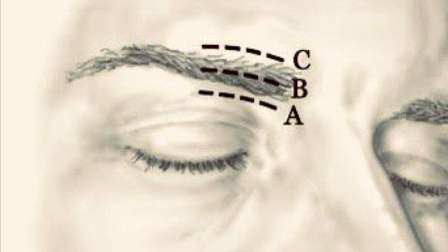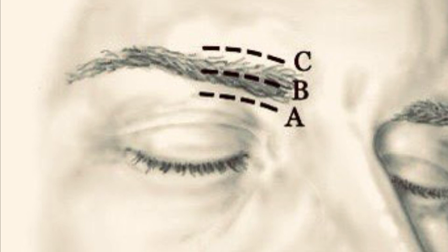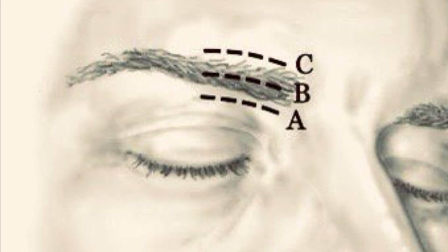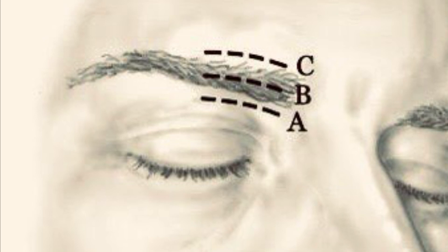The incision — small, about 0.5 to 1 centimeter — is made near the inframedial brow, typically 1 to 1.5 centimeters from the midline. For a better cosmetic outcome, we bevel the blade parallel to hair follicles, minimizing the risk of eyebrow alopecia.